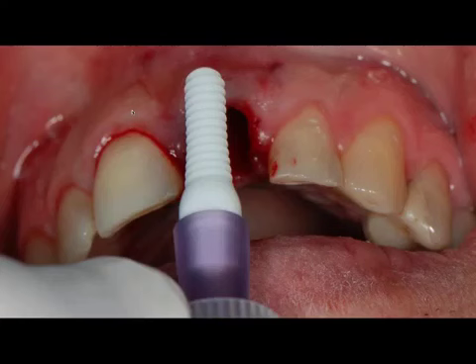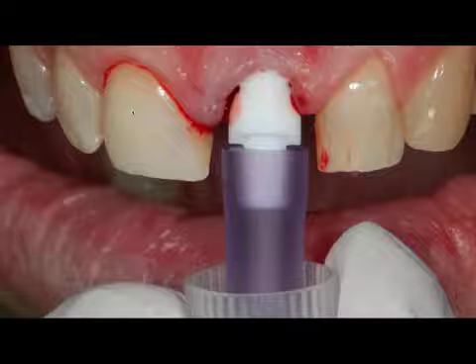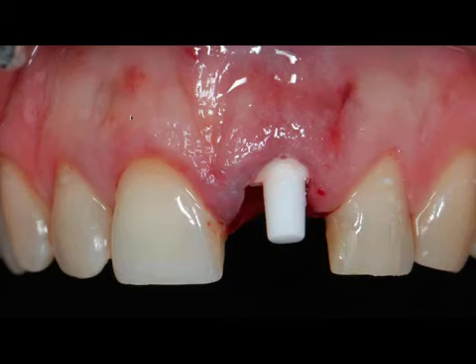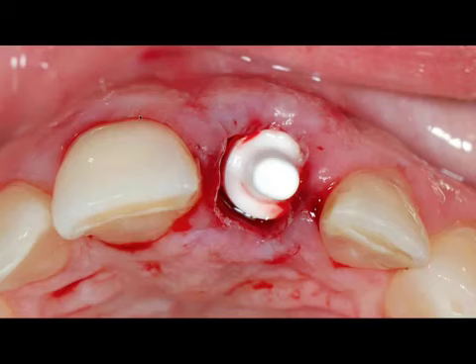The implant comes with a silicone carrier, and it's threaded into the osteotomy. Final positioning is done with a torque wrench, and we see here on this slide the final position of the implant with the restorative margin just slightly subgingival. We're going to look at an occlusal view in a second, and we're going to see that we have very nice positioning of that implant.